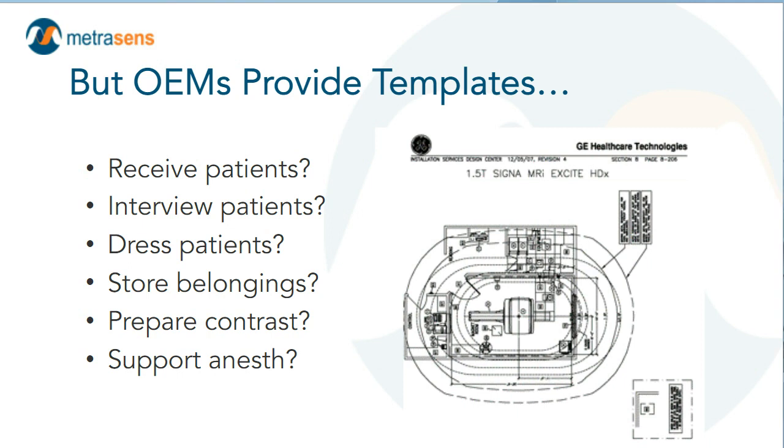None of these questions about the spaces needed to support the ancillary and support functions for MRI are shown in this suite layout diagram from the OEMs. And it's not their fault. I mean, yes, I suppose they could show us that, but their job is to sell us a product. And these happen to be the rooms that host their product. They don't sell reception desks.